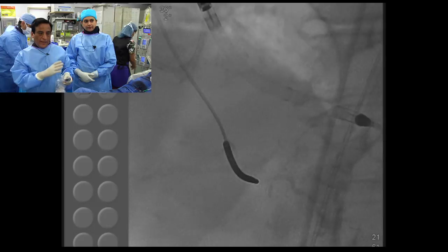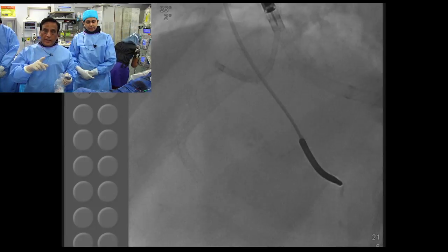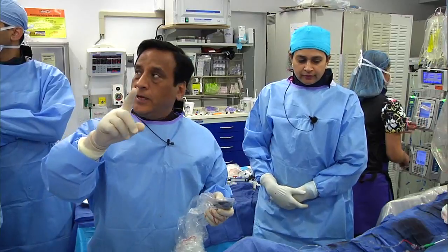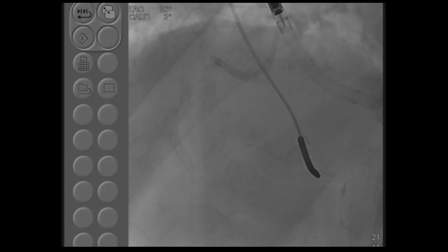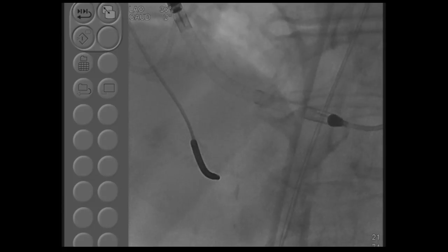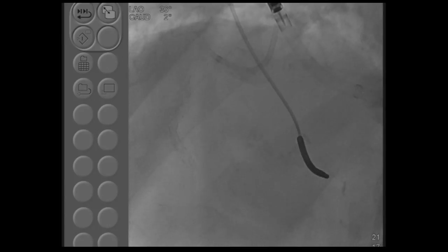So all put together, this system which has been created has really helped us to get to this. Now, if we can just show, and I'm going to finish this one very quickly. You see here now, we have put a stent, and you can see that there is a little bit of haziness outside in the mid-RCA. That is that tortuosity which the wall will fall off on the stent. So not to worry about. There's not a perforation. It's the normal tortuosity where the stent has been placed, and excellent results.